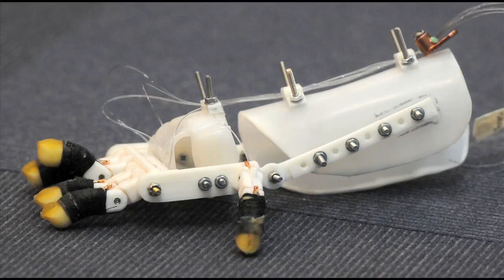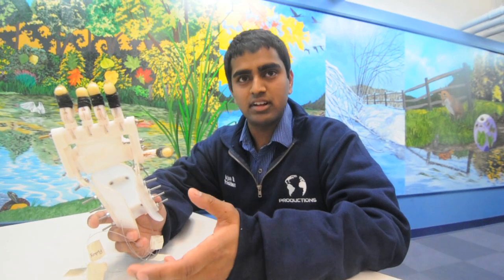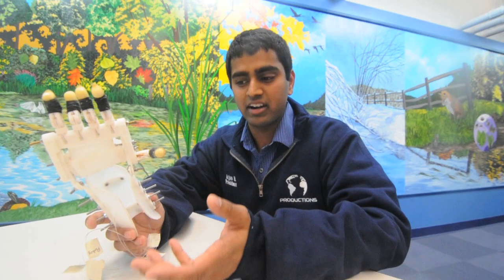This is the RoboHand. This is a project I've been working on since November, when we got contacted by Brookwood School with Mr. Lehrer, a science teacher, whose son Max has amniotic band syndrome and can therefore not grow fingers. The idea behind it is he wanted to make a hand that allowed Max to actually pick up and utilize his right hand.